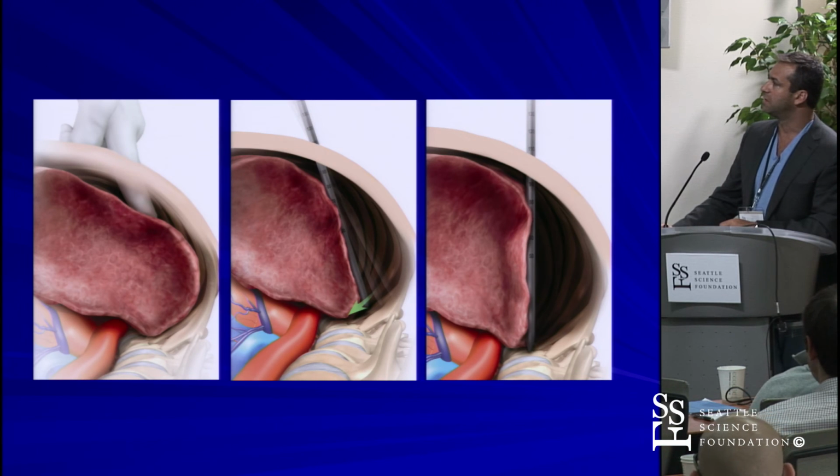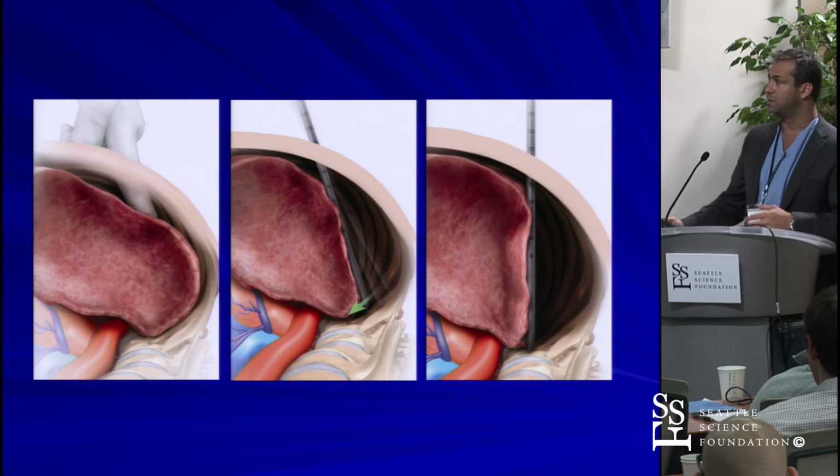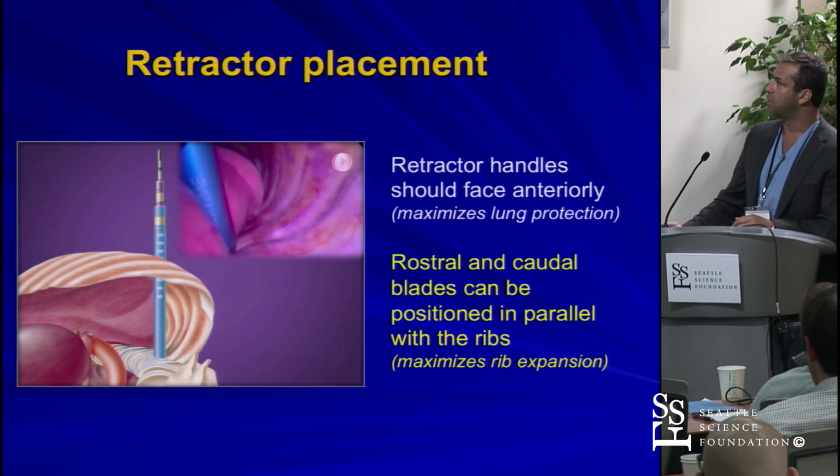And this is simply another image showing. Now obviously the entire lung doesn't get pushed away like this. The lung works around you, but starting off with your dilators, you want to make sure that you start dorsally and work your way anteriorly.